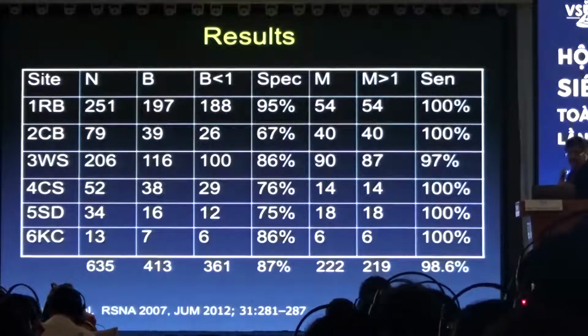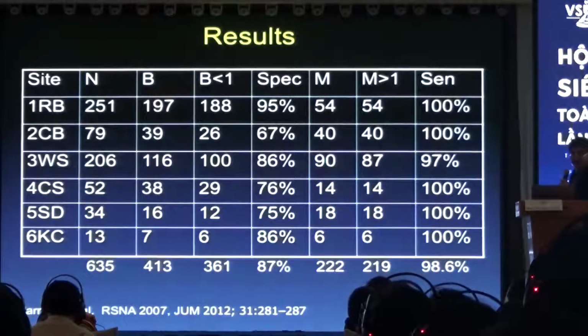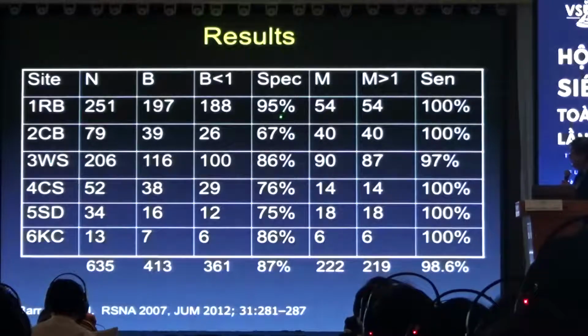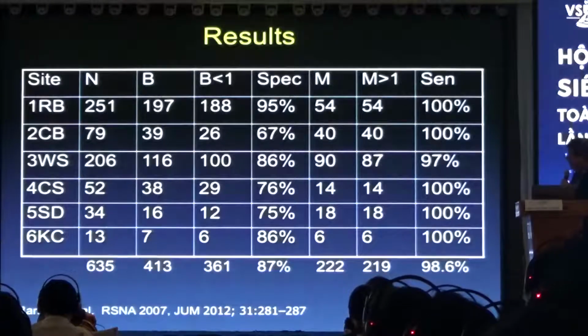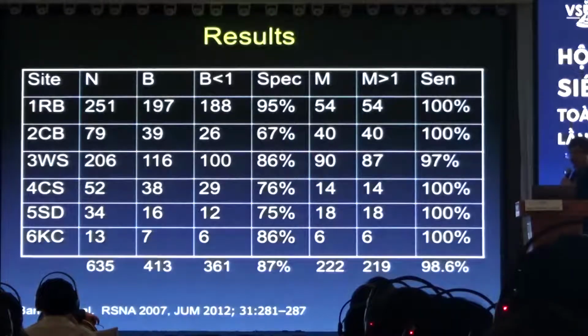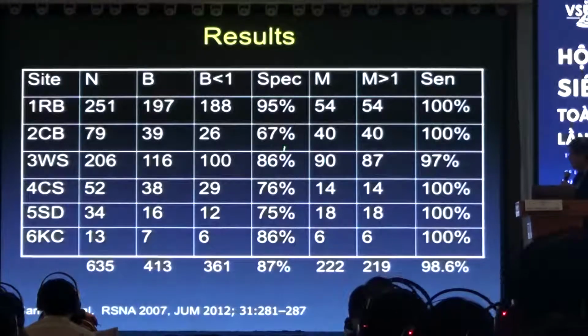And we learned a little bit of information from this, because these 3 cases were cases of DCIS, where you couldn't see the lesion well on B mode, so we think they measured the lesion wrong. If you look at the specificity, it's much different, kind of a wider spread, but still a very good number of 87%. And we did this study before we really understood about pre-compression that I'm going to talk about shortly, and I think that was part of the problem, is that people didn't realize how to do a much better job. But you can see we're very happy with these numbers.